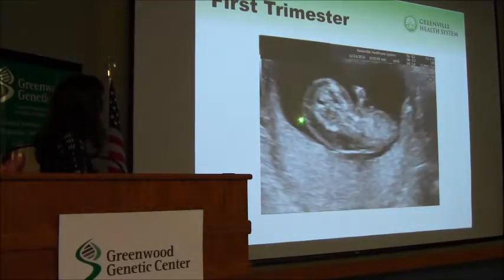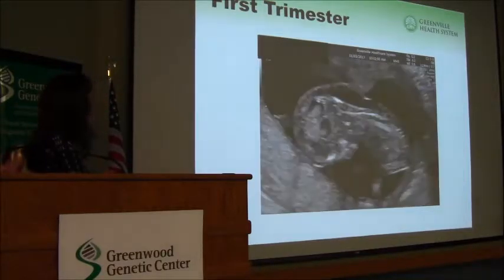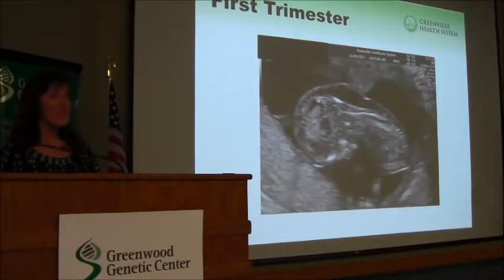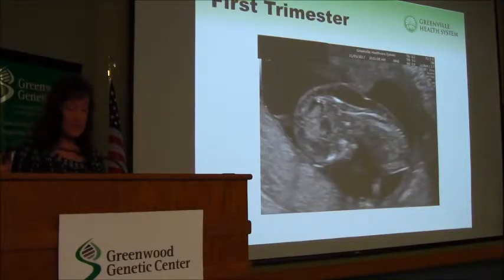This is a very pronounced thickness, cystic hygroma. I have one more picture of that you can see right here. Again, associated with several different genetic conditions like Turner's. We also see it sometimes with children that have other aneuploidies. It can be a sign of fetal hydrops to come, and you can have lymphedema that causes this.